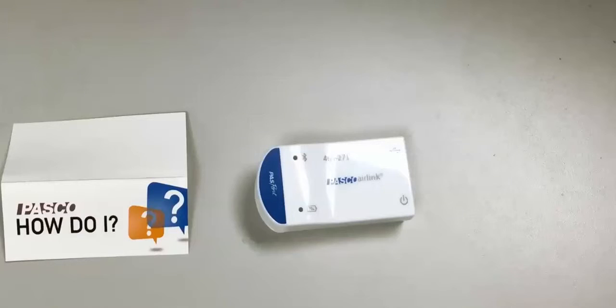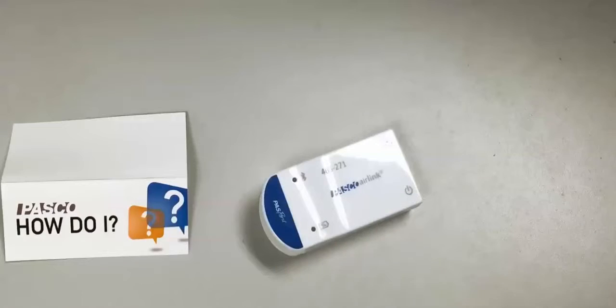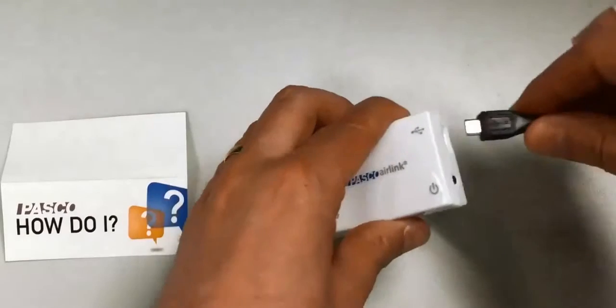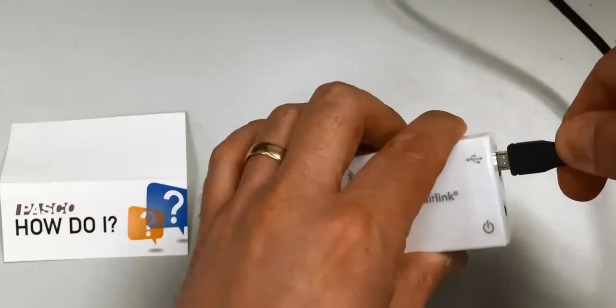This is a video showing how to reset the air link. So on the end of the air link we have the USB port and the power button. Using a USB cable that's attached to external power, firmly attach that to the micro USB connector on the end of the air link.